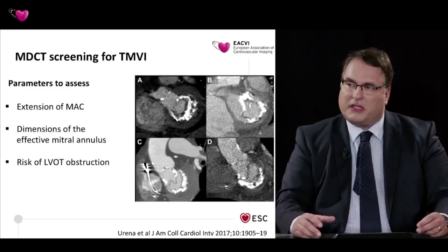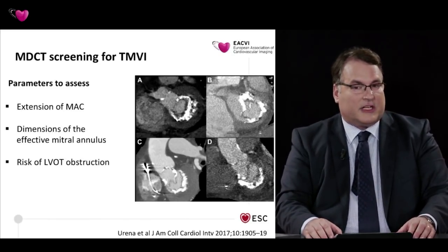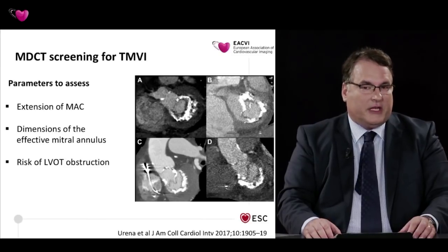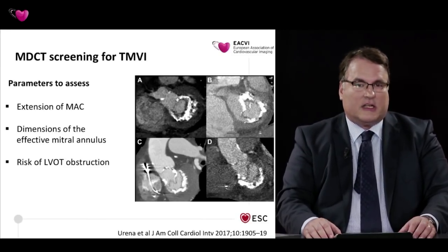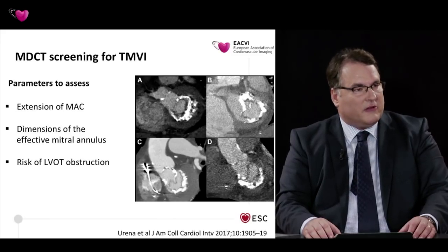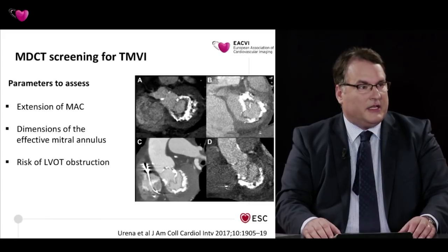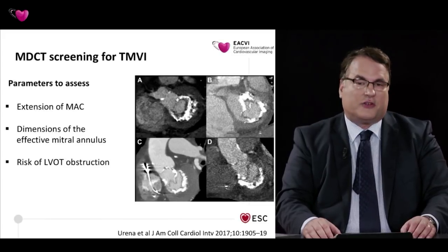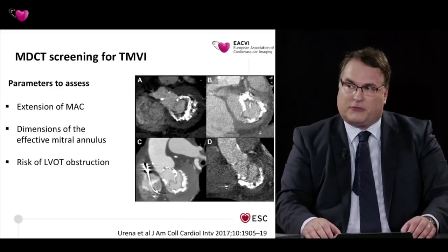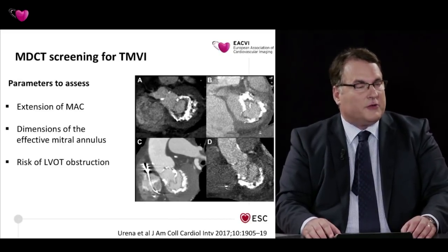And also in Munich, there have been several implants, but there have also been fatalities. And you're nicely pointing out that one of the biggest reasons for fatalities was actually disregard of the potential obstruction of the valve directly at the implantation, but also over time in the ongoing months after implantation. And this major risk of death for this patient is ongoing LVOT obstruction.